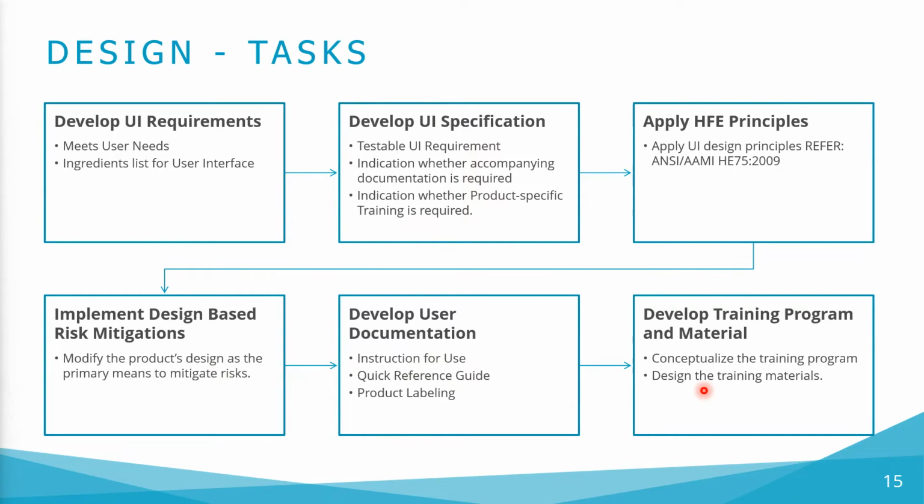Develop training program and material. Similar to user documentation, we might also provide training to users to teach them about the product and how to use it safely and effectively. During this step, we should consider whether to implement a training program, and if the answer is yes, then you will conceptualize the training program and design the training materials.